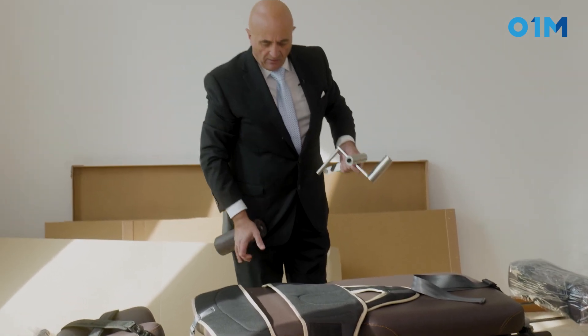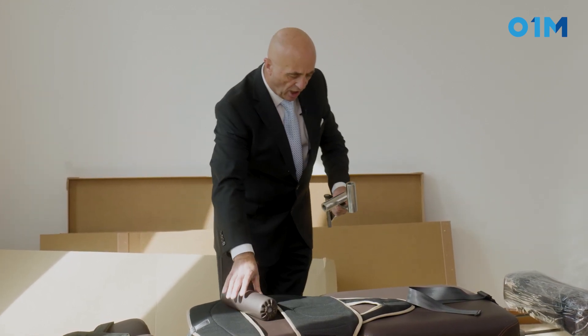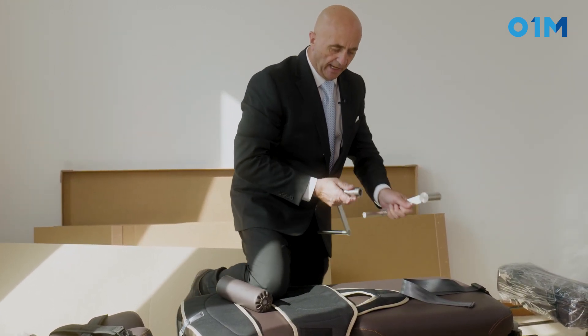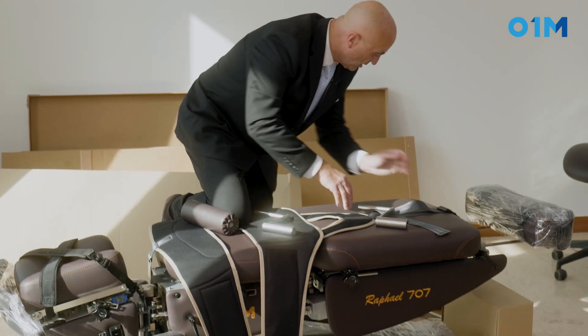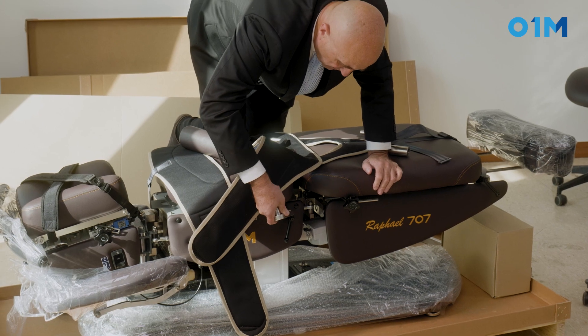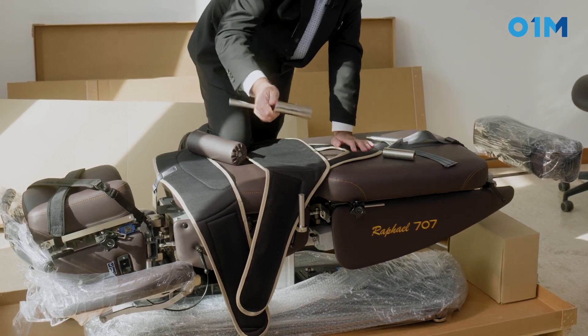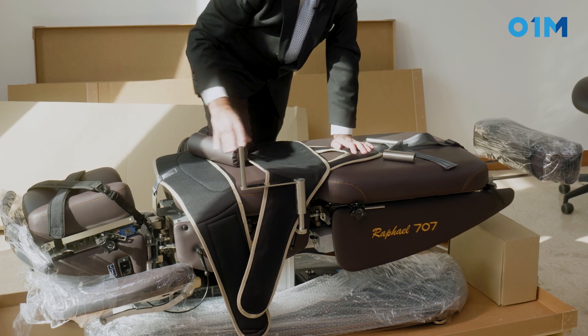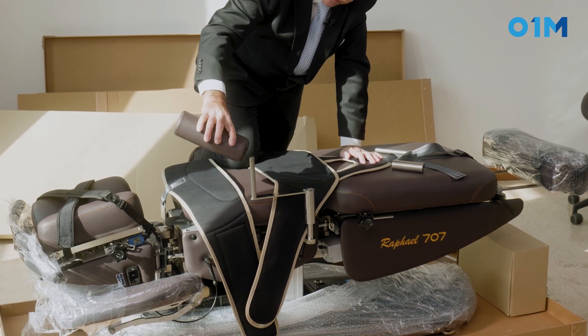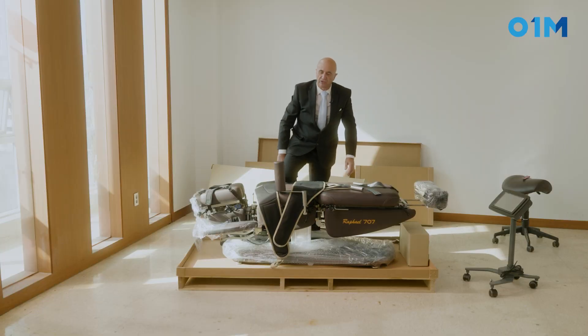We have here already set up on the table the system for the cervical traction. This we call the roll — it will be the underarm axillary roll. They are in two parts: one part goes right here, the second part slides in, and then finally you stick the roll in it. You have two of them.